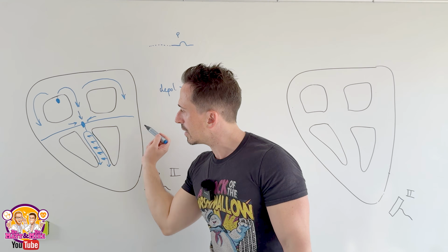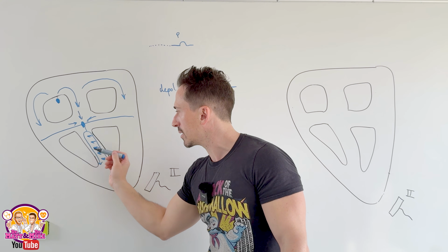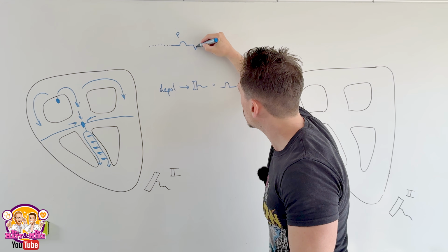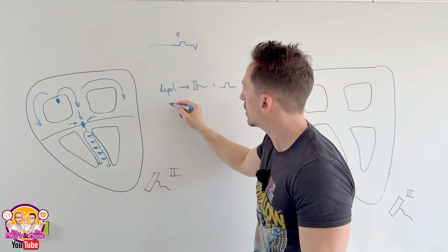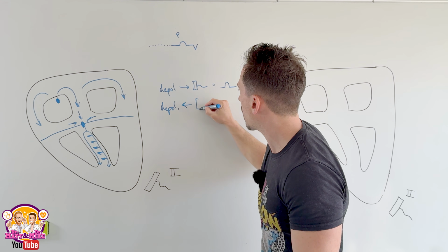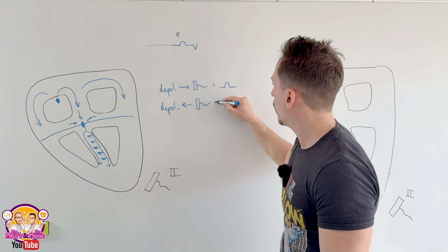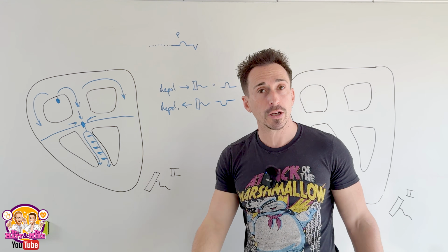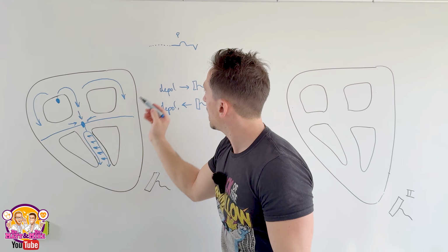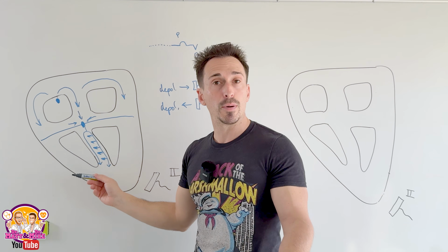Now, as you can see, that's where the depolarization event moves through. Most of it is happening in these short, sharp fibers here of the bundle branches away from the lead. So we get a short, sharp depression. Now you might be thinking, why depression? Because when we have depolarization happening away from the lead, we get a dip down or a depression on the ECG trace. So that's why we've got that depression there. That's called the Q wave, the interventricular septum depolarizing.